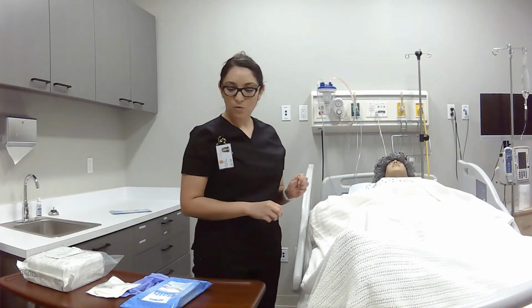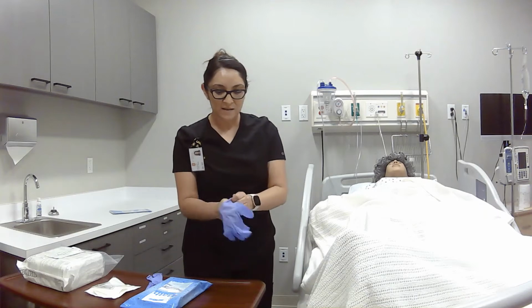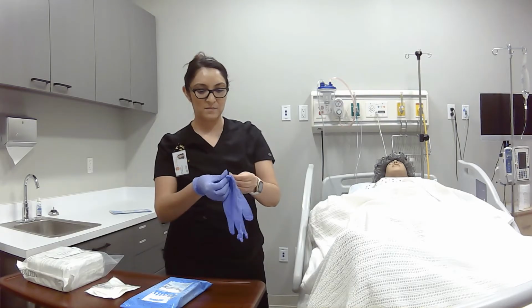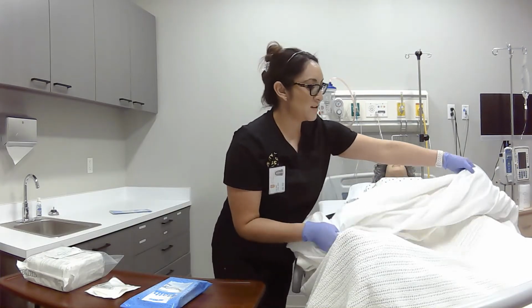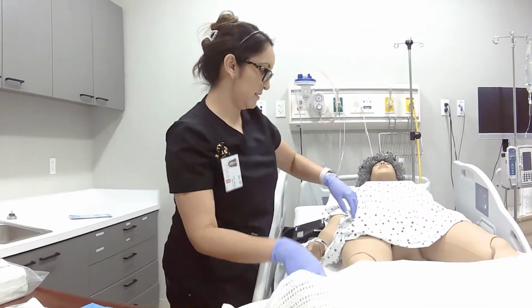So Ms. Adams, what I'm going to do is, let me put my gloves on, and I'm going to get Ms. Adams ready to go for the peri-care. So I'm just going to bring the covers back.